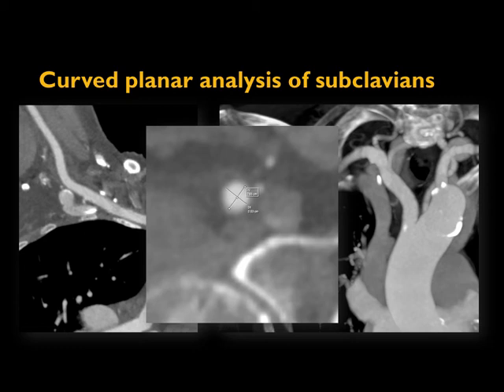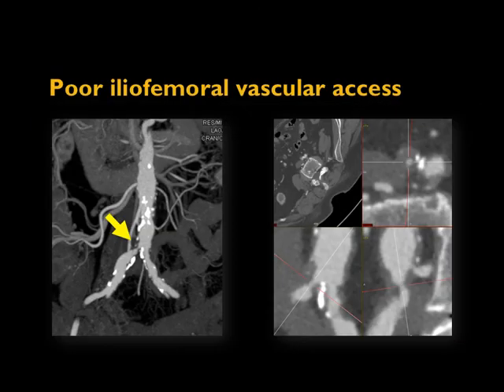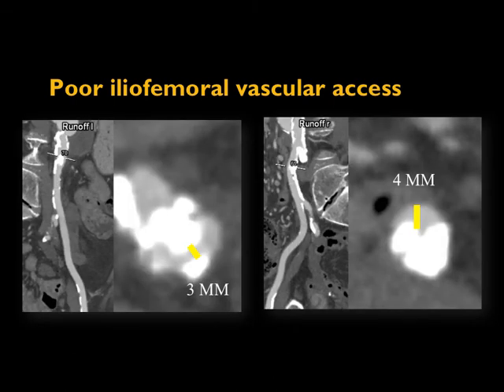We provide subclavian measurements only when needed — if the iliofemoral route looks good, there's no need to assess the subclavian. Here's an example of a case with very poor iliofemoral access. An important note: if you identify a discrete lesion, this patient might be able to receive a stent to allow sheath insertion. However, a patient with extensive bilateral calcification would be a much harder stenting candidate and may need subclavian or another alternative access route.